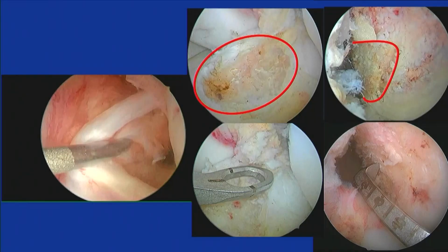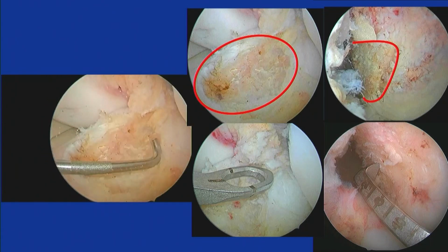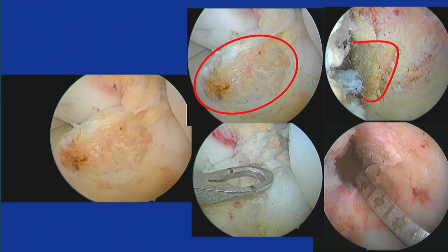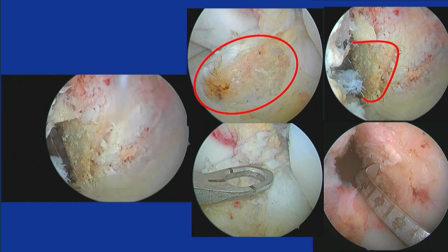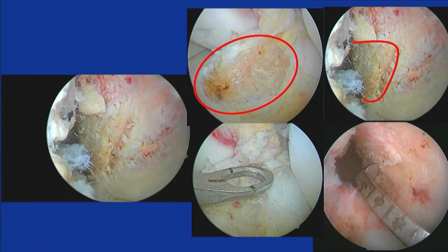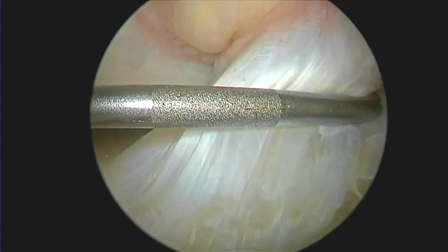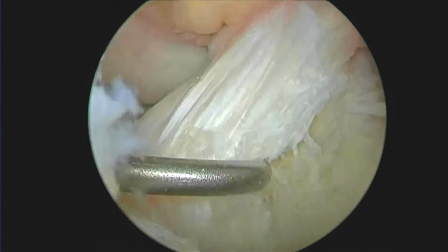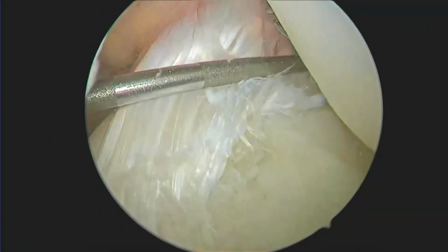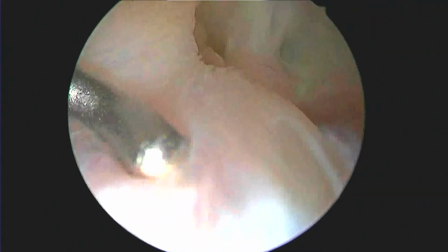So what about the surgical technique? First of all, you do your ACL, you see the footprints of the femur and the tibia. We don't say landmarks anymore. We always say footprint because everybody's footprints are different and we have to put our ACLs on their footprints, individualizing the ACL surgery.